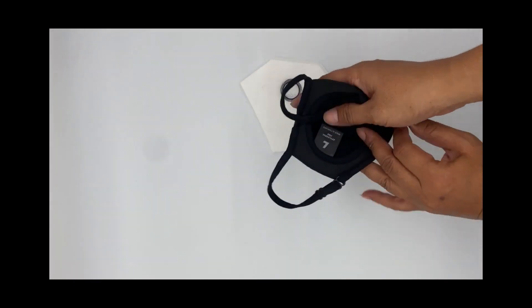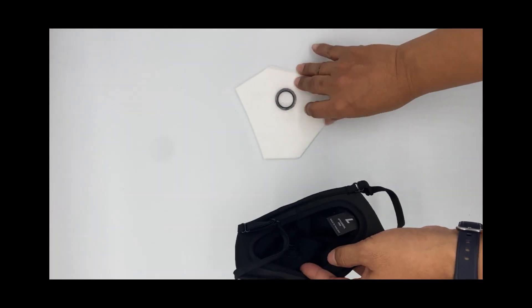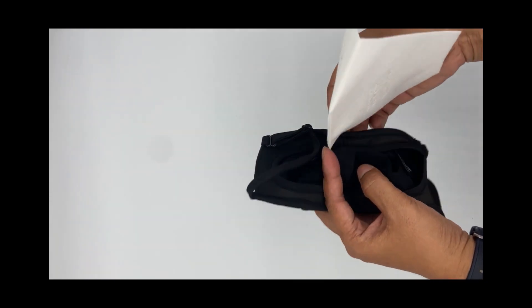The Pro Smart Valve Ready filters have a snap ring welded to the inside. The snap ring holds the filter to the smart valve.